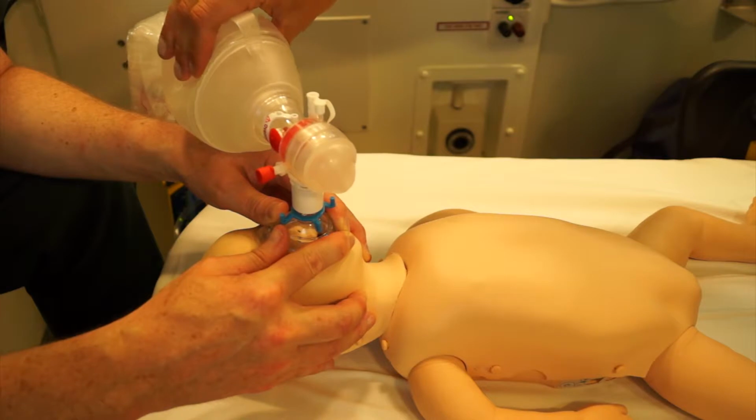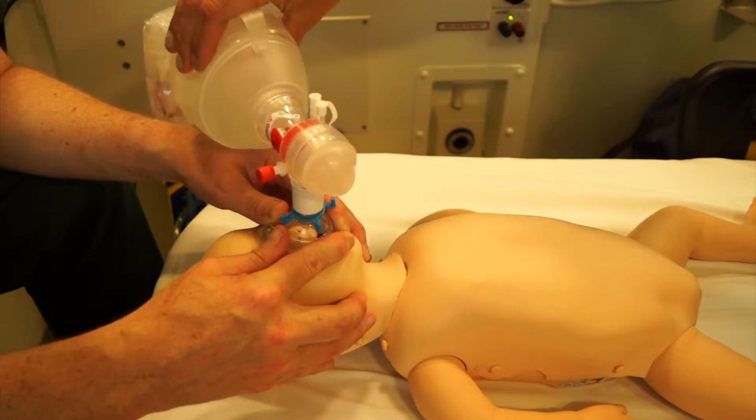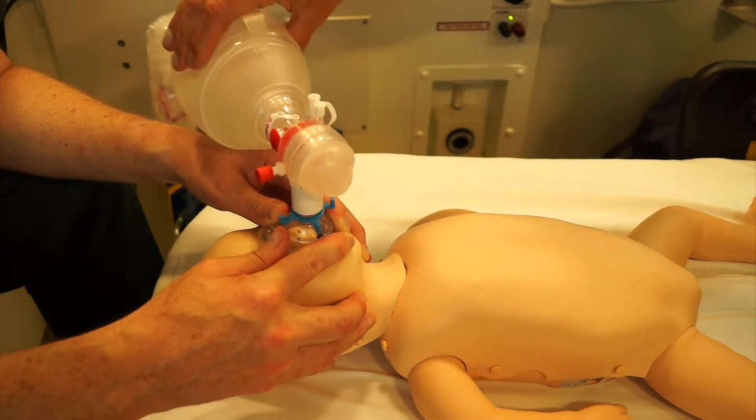Having achieved neutral alignment, you could now attempt a 2-person jaw thrust technique in order to achieve successful inflations.